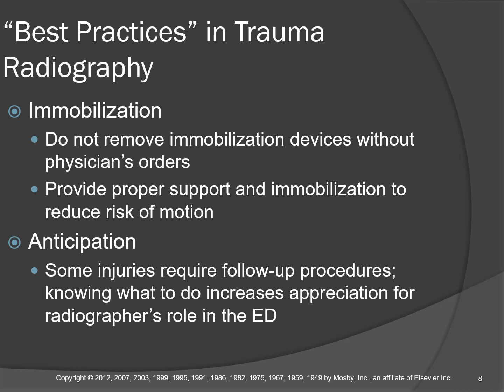Immobilization. You can't remove immobilization devices without a physician's order. I'd be comfortable with a verbal, but some of you may not. Some of you might want a written order that the immobilizer can be removed. Provide proper support and immobilization to reduce the risk of motion.